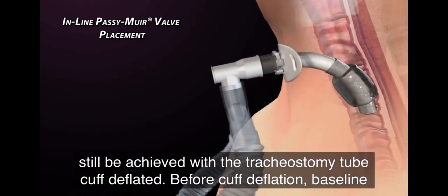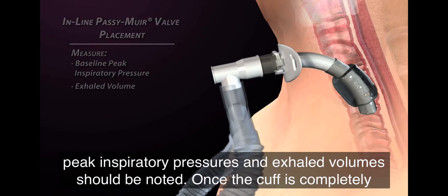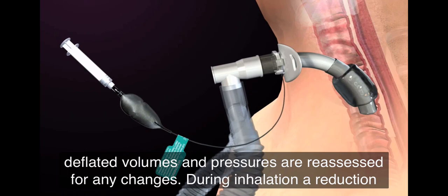Before cuff deflation, baseline peak inspiratory pressures and exhaled volumes should be noted. Once the cuff is completely deflated, volumes and pressures are reassessed for any changes.